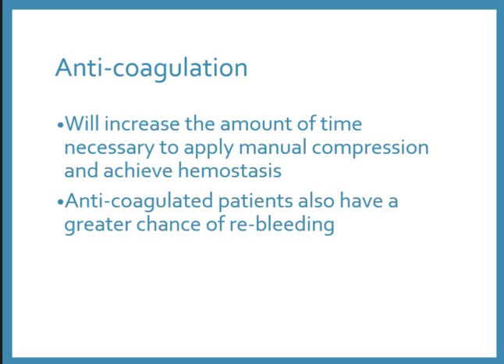Patients who come from the cath lab typically receive a gaggle of Plavix, a gaggle of 2B3A, heparin, all this stuff that makes them bleed. So you want to make sure that you hold the full 30 minutes, and you may even need to hold longer, just depending. The other thing is that these patients are at a higher risk of rebleeding.